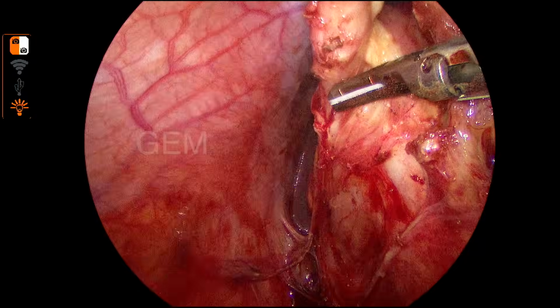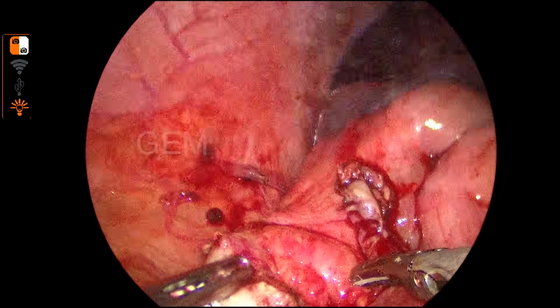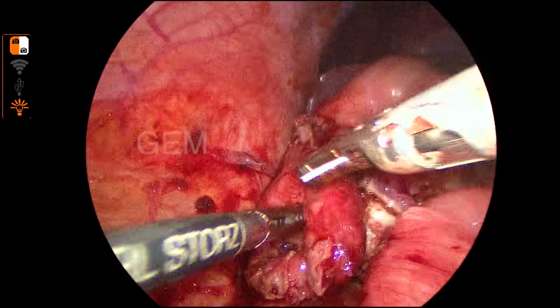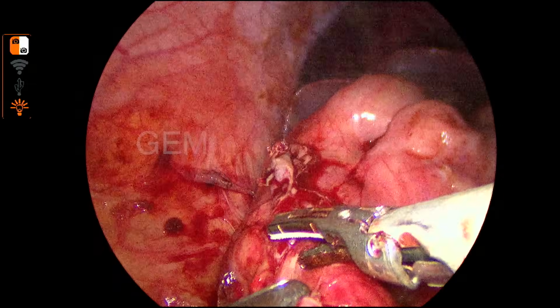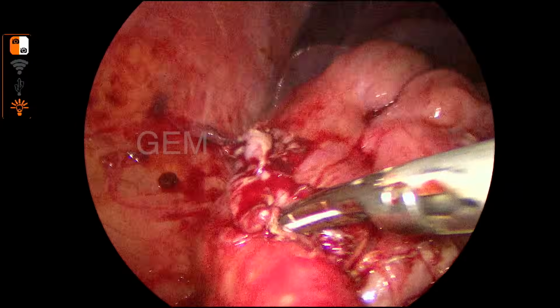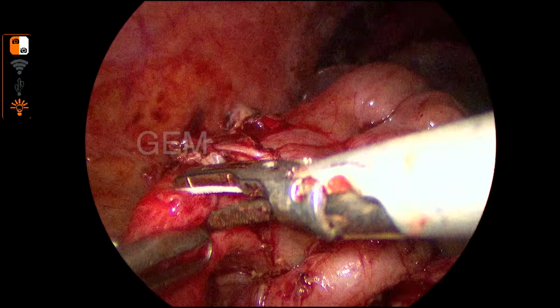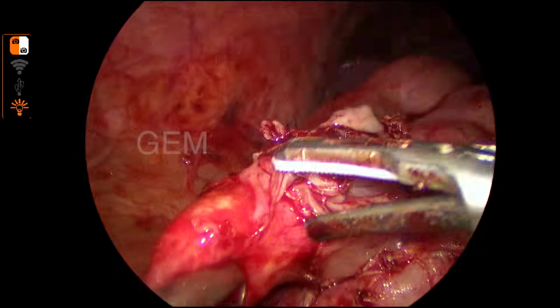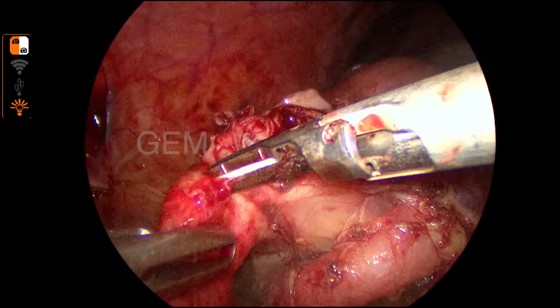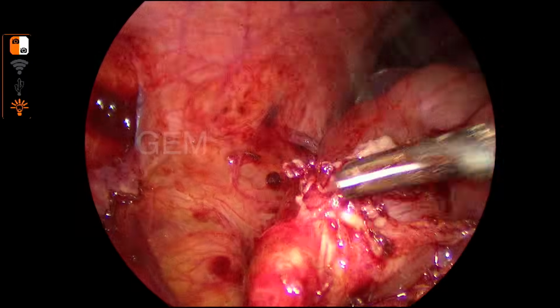And I demonstrated one of this case, and the entire appendix is adherent, a case treated conservatively outside. The entire appendix was on the cecal wall, and after the surgery, the moderator comment was, it is very nicely done. Otherwise, you will injure the cecal wall. So that's what happened in some cases. So you have to do it very carefully.